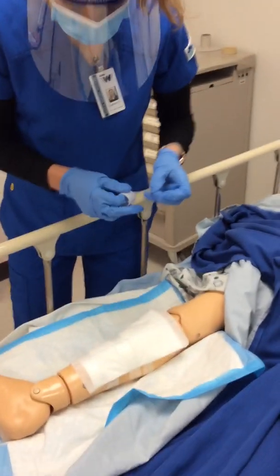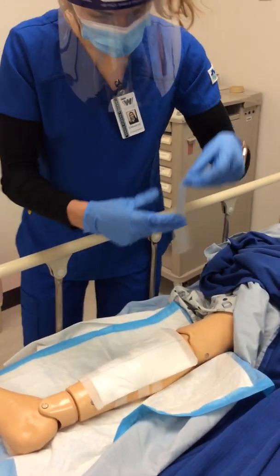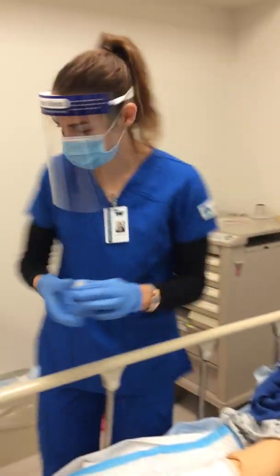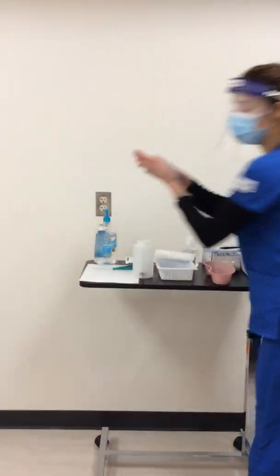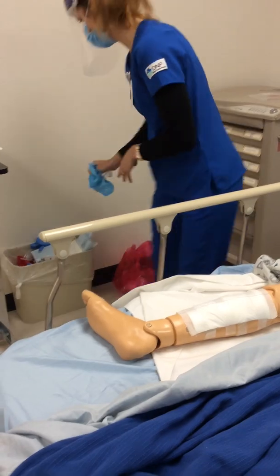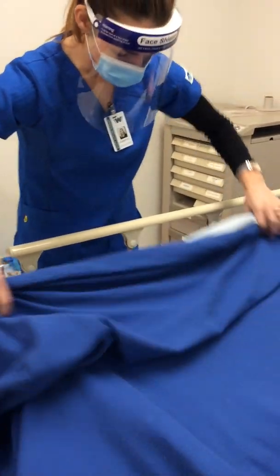And one last piece. All right, how's that feel, Shirley? Good. I'm going to remove my gloves, remove my PPE, wash my hands. And before I would have removed my gloves and washed my hands, I would have gotten this discarded. And then we're going to cover up that leg.